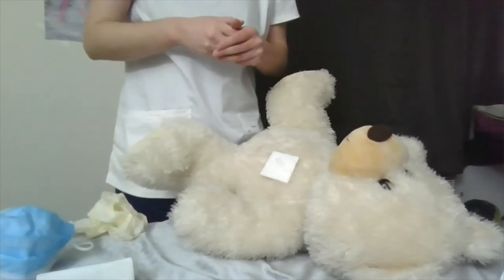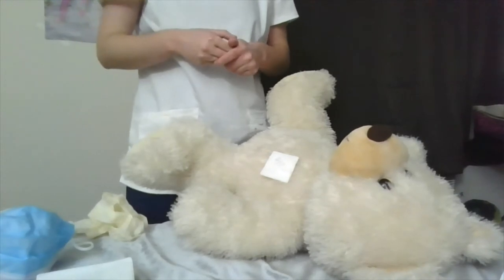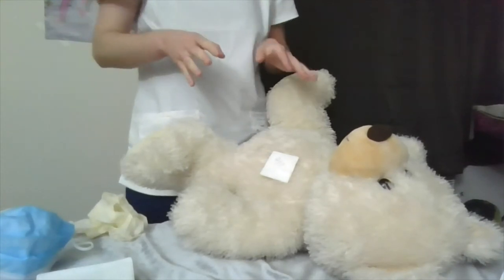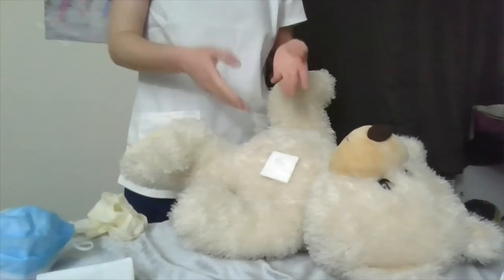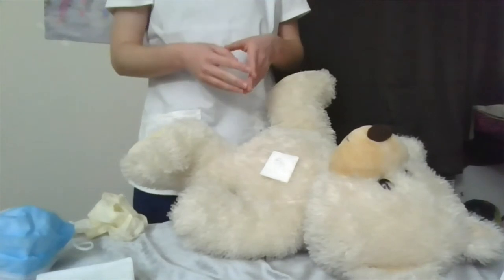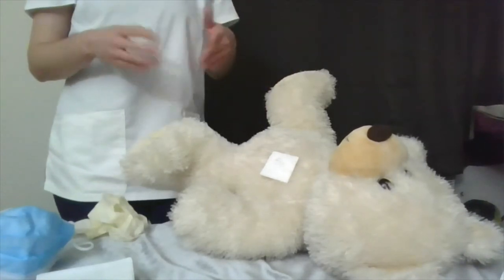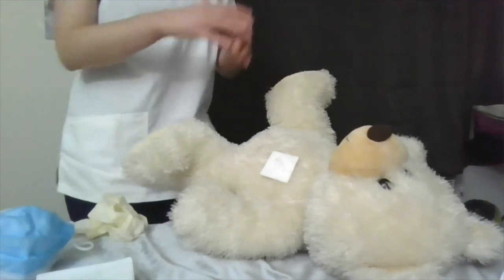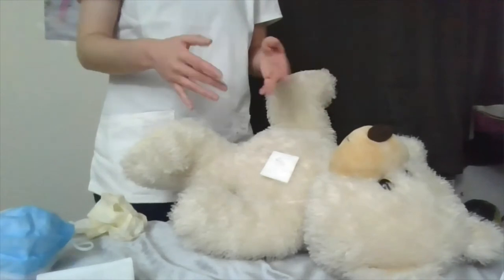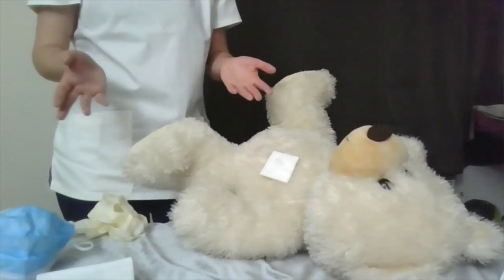To start the procedure, I'm going to identify the patient by asking their name and date of birth. Patient is confirmed. I'm going to identify when the dressing was last changed. I've seen in the system it was last changed seven days ago — they have the clear dressing, so that is within protocol.